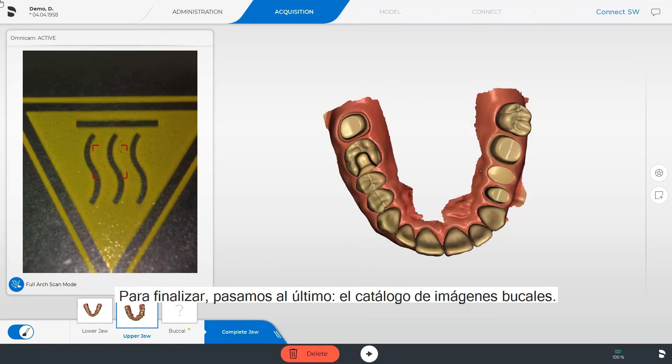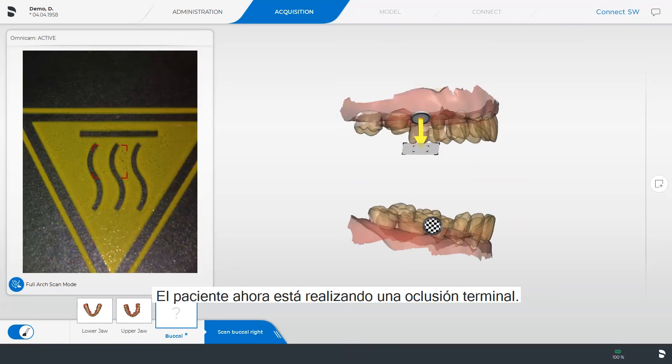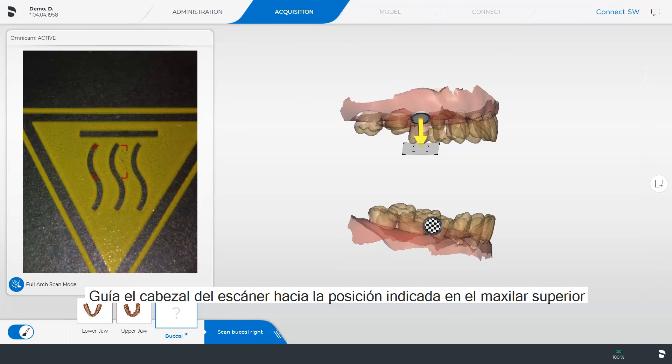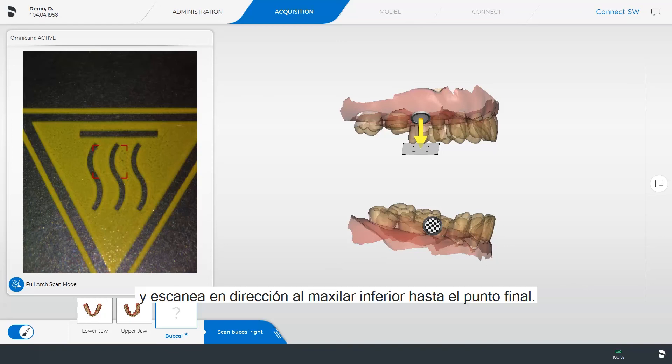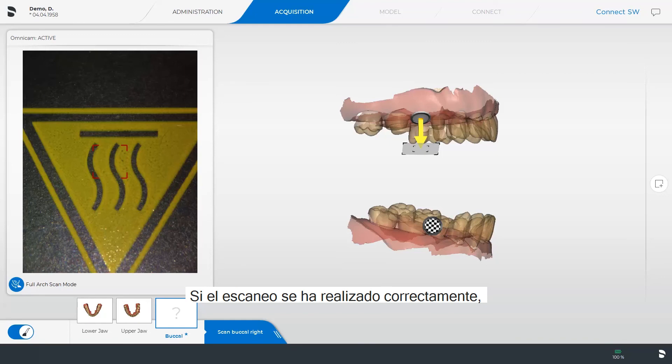Finally, we switch to the last image catalog: the buccal image catalog. The patient is now performing the terminal occlusion. Guide the scanner head to the indicated position in the upper jaw and scan towards the lower jaw up to the end point. When a green check mark is displayed, the scan was successful.